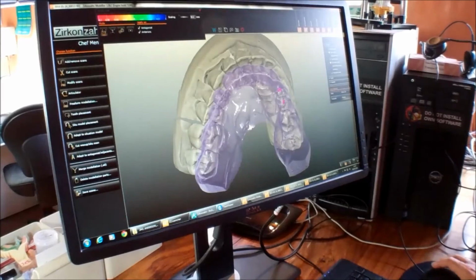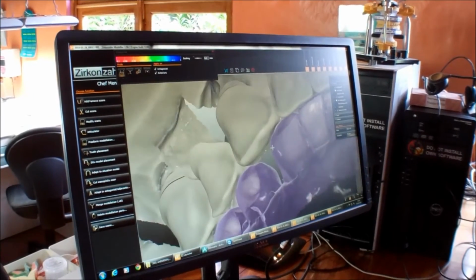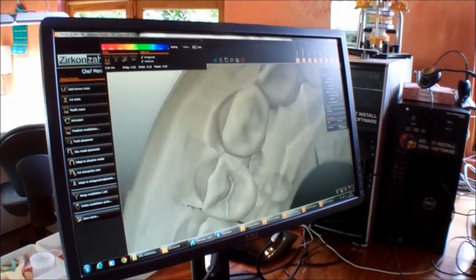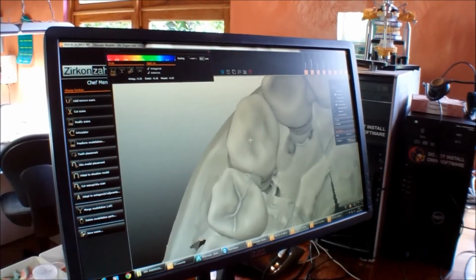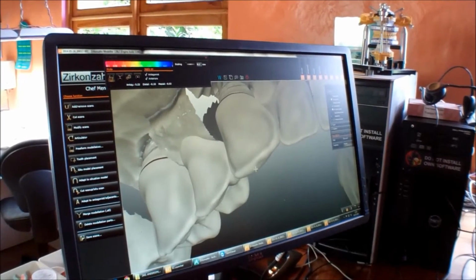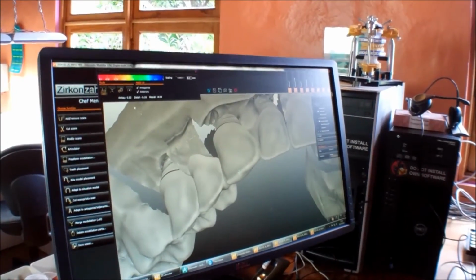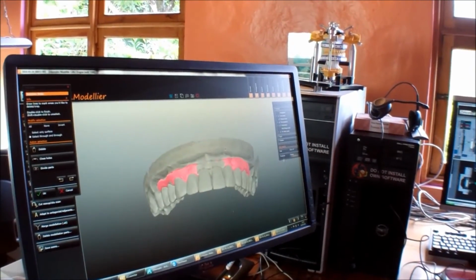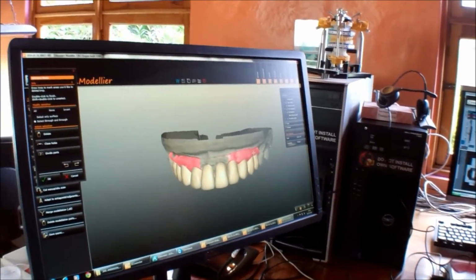Look at this. The guide is this one. I show you where we did this. I don't know if you can see this shadow. Yes. And this is where you go in materials. The material gets here. Here is the top, the cusp. And from this point here, I put porcelain. Oh, okay. This is the reason why you are not going to have chipping or layering or something else. Very nice. Yeah, so it's going to have all the advantages of the very good, strong zirconia, and the beauty of the porcelain layer on the front.